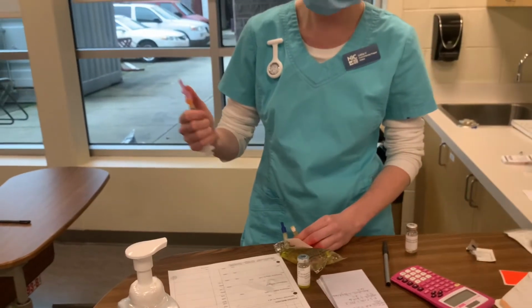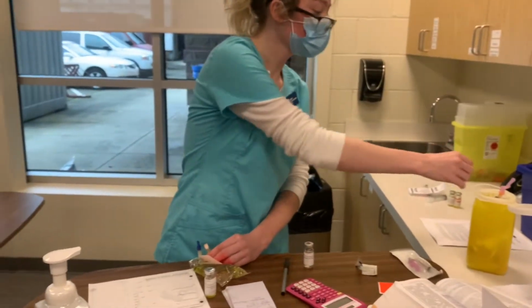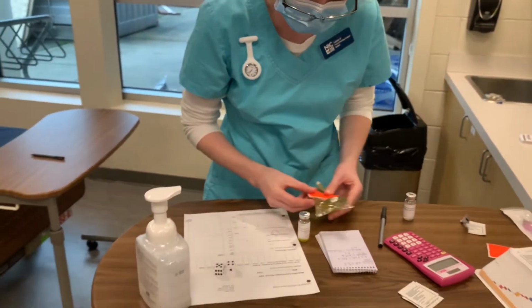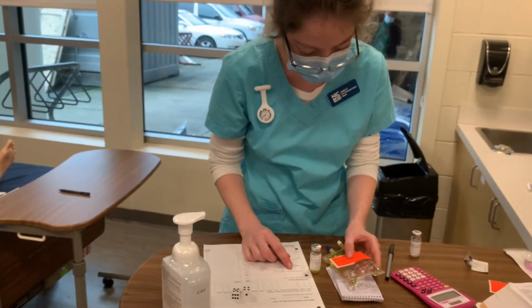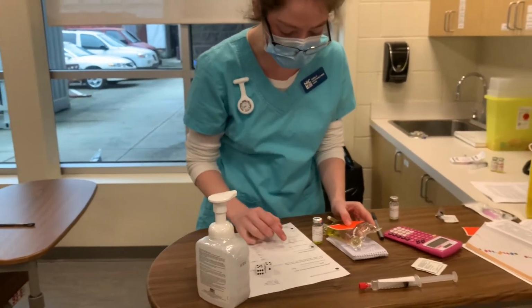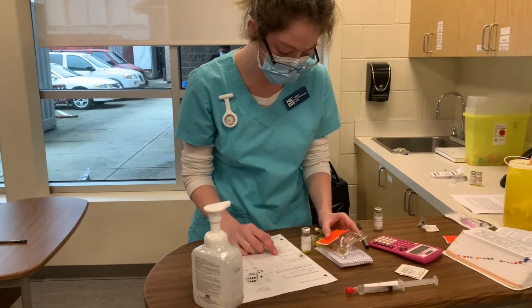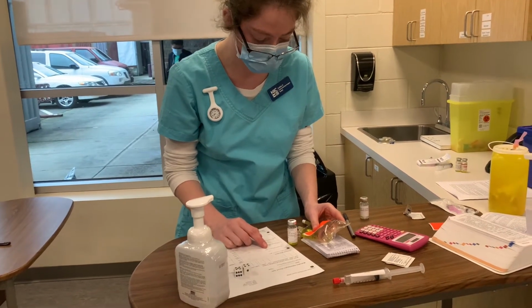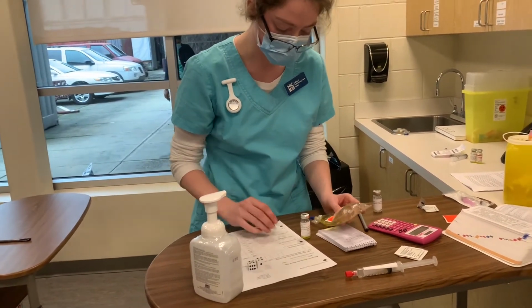Safety feature in the sharps box. And I check it another time. I have cefuroxime 500 milligrams in 5.3 milliliters for Anna Perry at 0800, a prophylactic antibiotic via IV every 8 hours. And that's all of them.